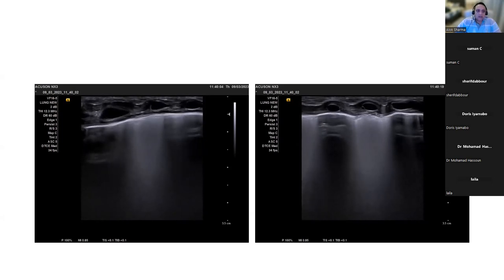Okay. This can be done on the machine, and you can do it in your preset setting just by pressing the buttons. What I'd say is that you leave them in that setting, and on the next presentation, I'll show you how I image optimize while I'm doing it in real time.